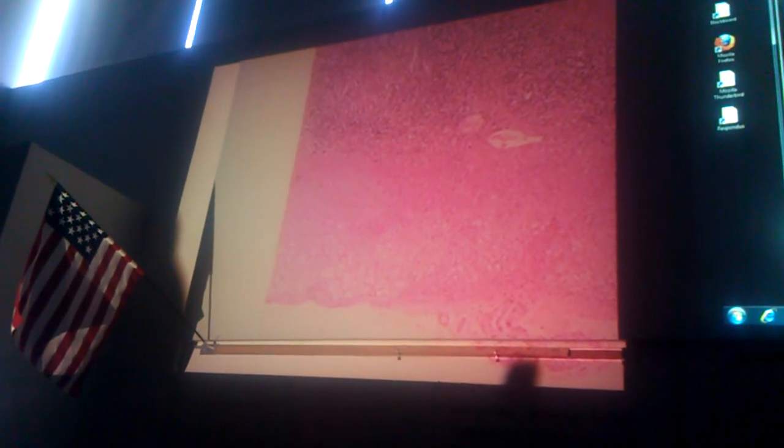And then this is the adrenal gland that we talked about today. The capsule around the outside is here. And then you have the cortex made up of 3 zones. It's light staining because they make corticosteroids and they've all been extracted. And then this is the medulla, and the cells there make epinephrine and norepinephrine. And thus they're dark staining.